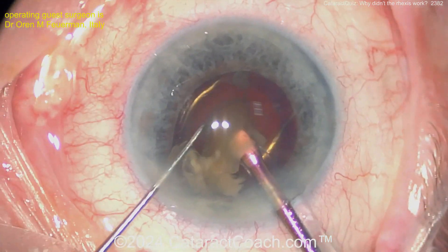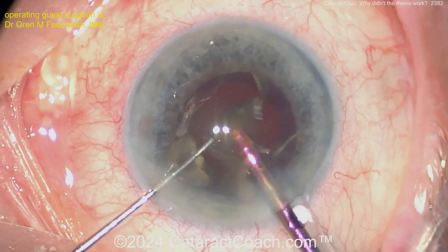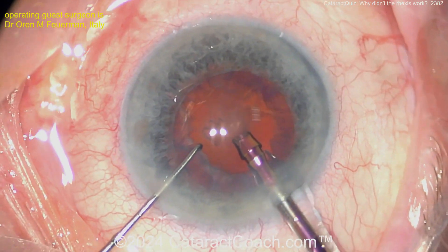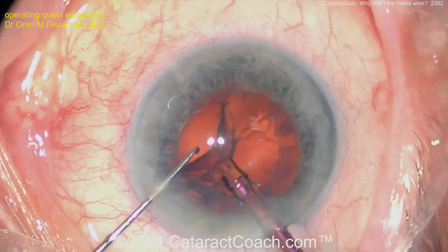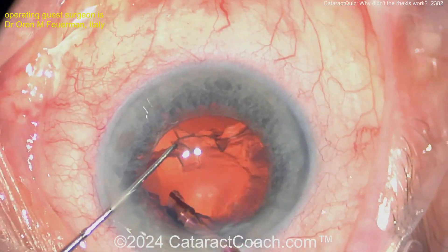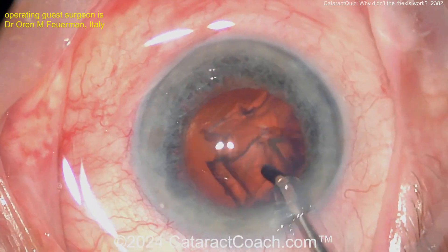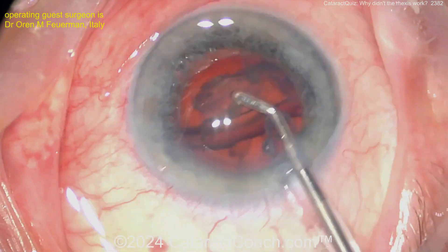Here's a beautiful chop technique removing the nucleus. At the end of the case — is the zonular support normal? Is the posterior capsule normal, or is it doubled up too? Let's be very careful here. Cleaning up the epinuclear shell, switching to the IA probe — and taking this out. The rest of the capsule appears pretty much normal.